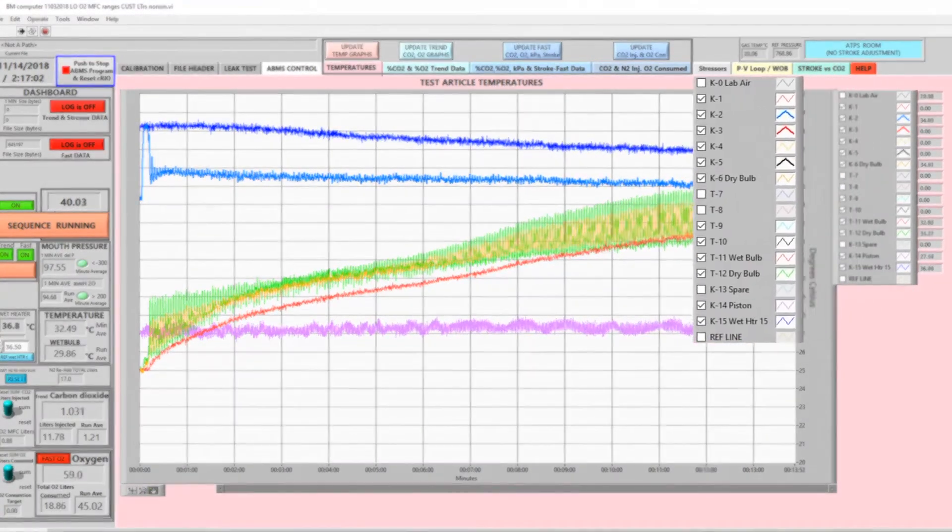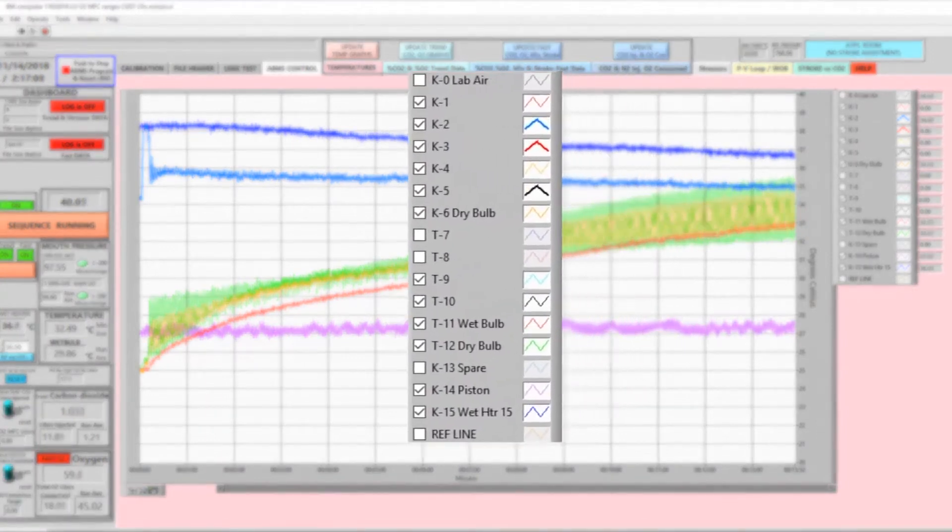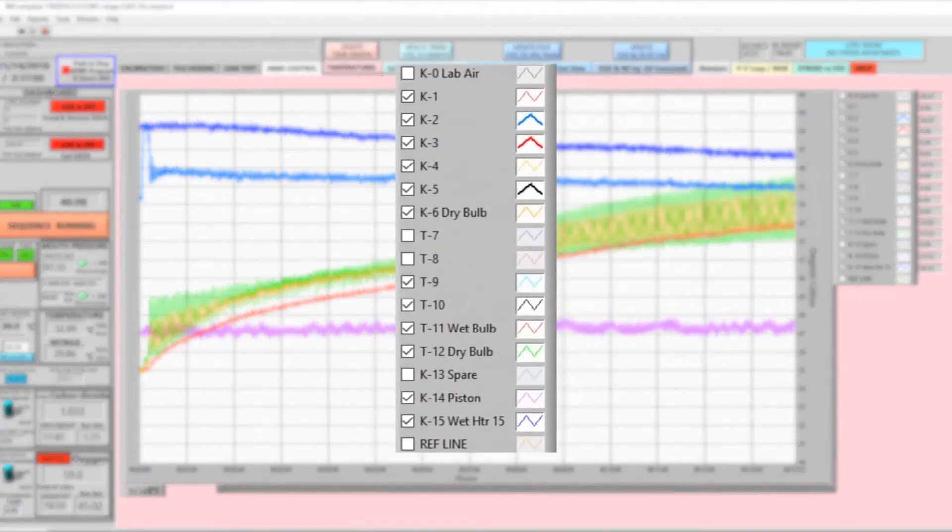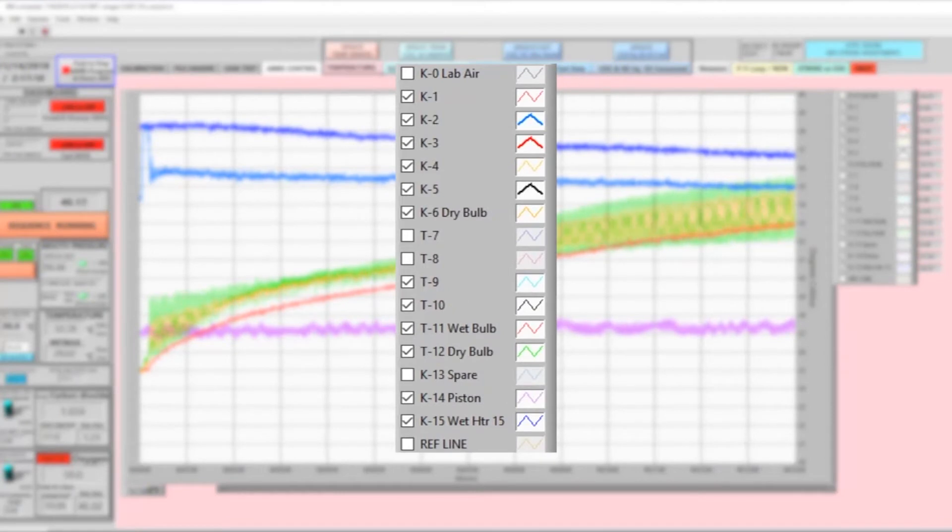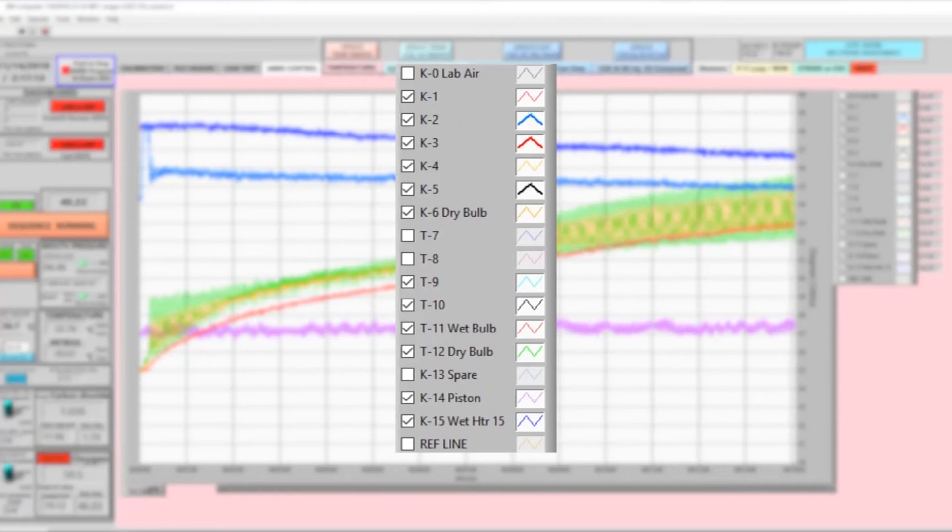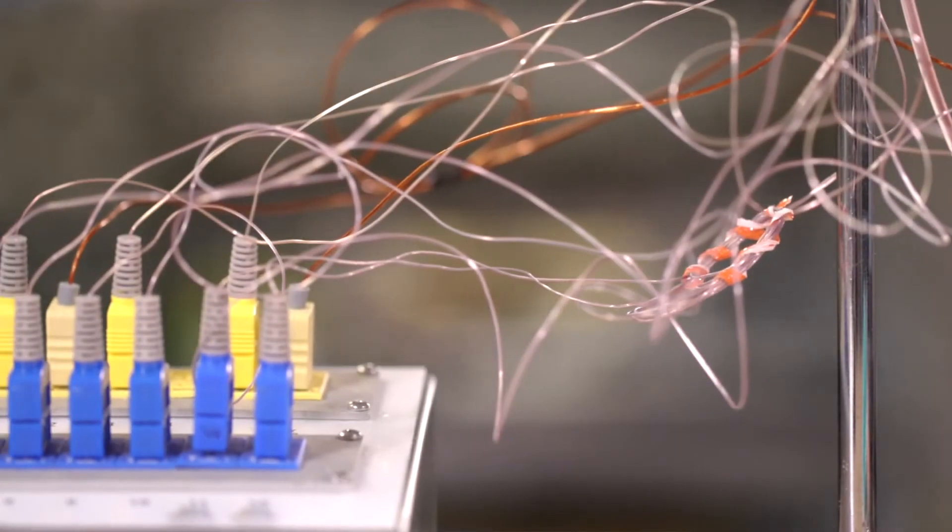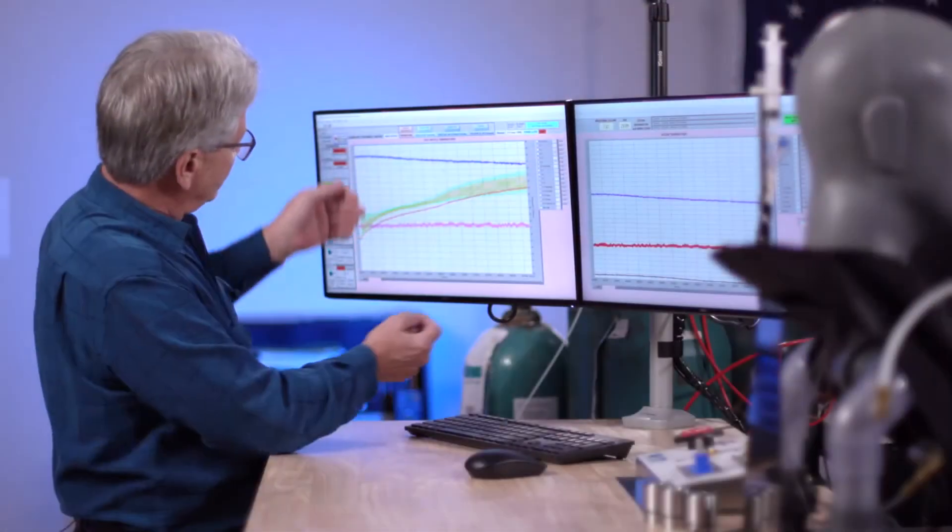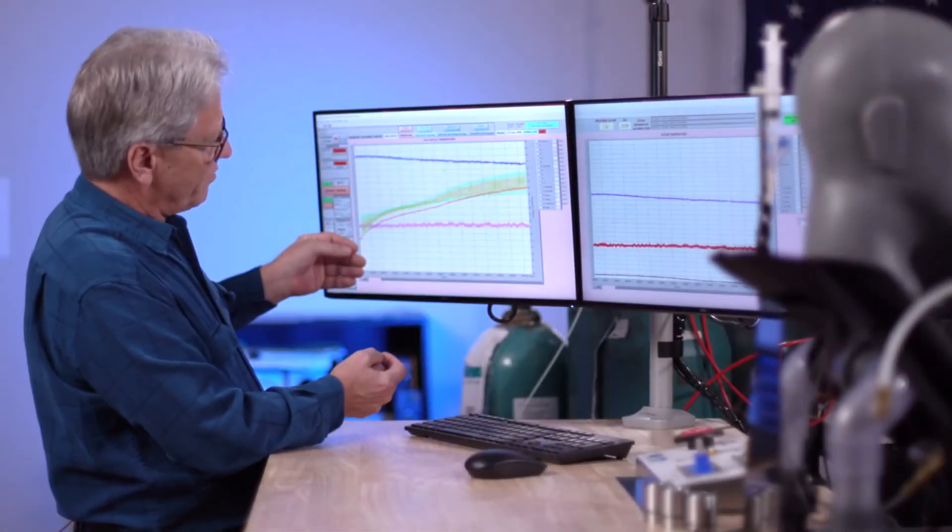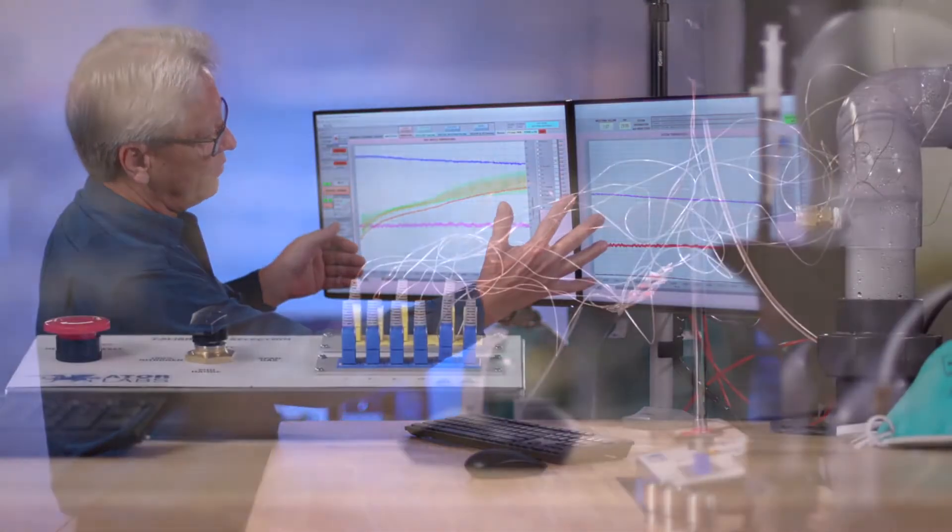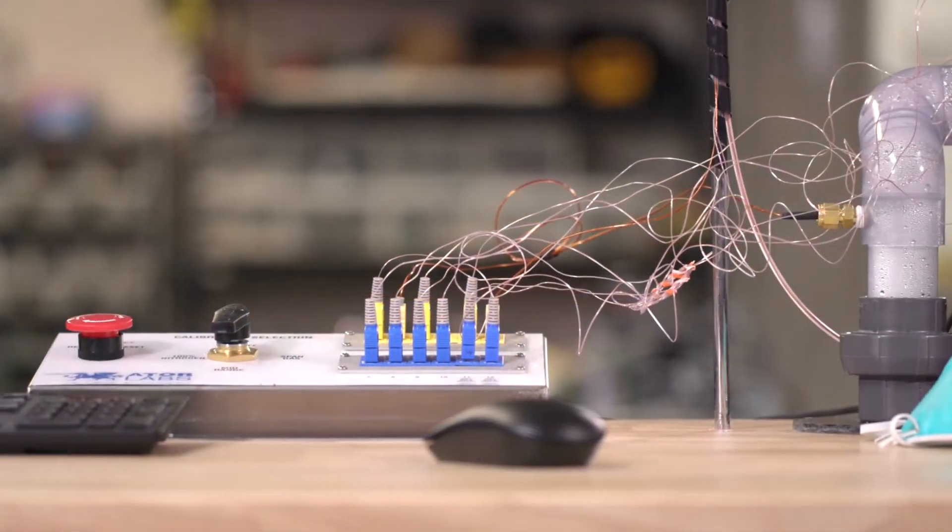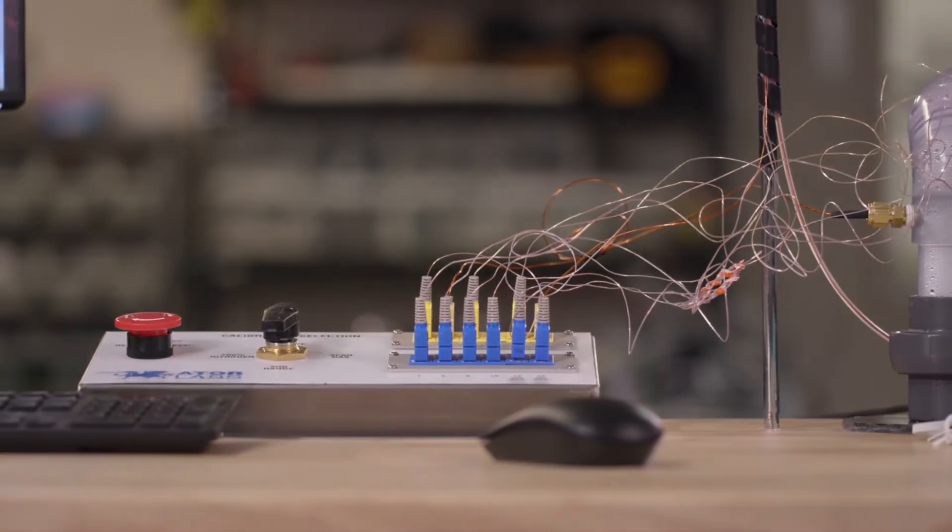Additional probes that the user may wish to see can be brought up by clicking on the individual channels and bringing those to the front or hiding them if one tracing blocks another behind it. Temperatures are tracked throughout the study in a graph manner that allows a zero point to remain on the screen and then new data is brought in from the right hand side.